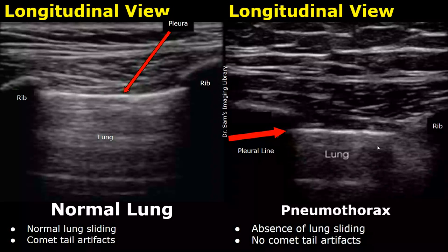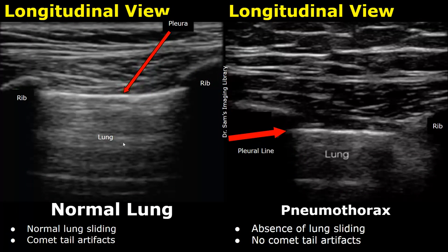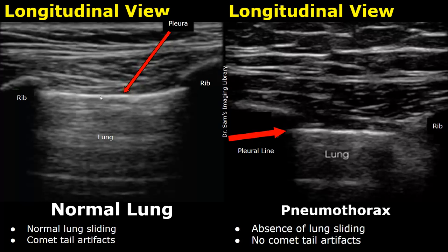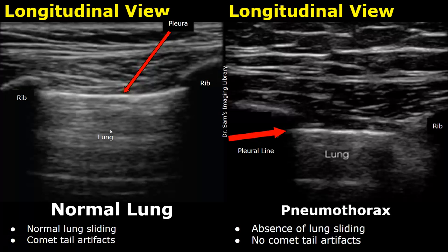The anterior pleura and lung can be scanned as part of the E-FAST, or Extended FAST exam. We can check the anterior pleura and lung tissue to assess for pneumothorax. These are longitudinal views of the chest showing the ribs and the lung tissue in between. This hyperechoic line is the pleura. In normal cases, we will see lung sliding, which consists of normal lung movements during respiration seen in real time. We will also find comet tail artifacts — a series of hyperechoic striations. In a case of pneumothorax, there will be absence of lung sliding and no comet tail artifacts.